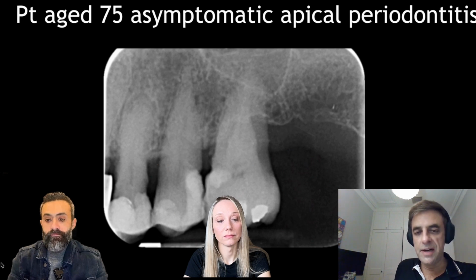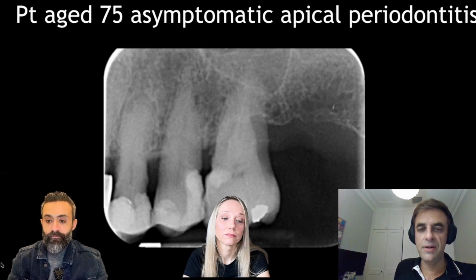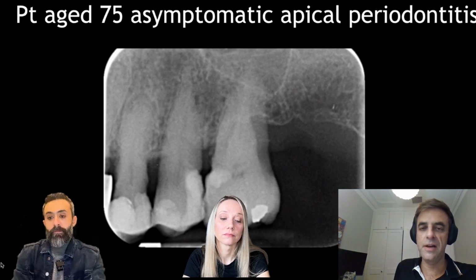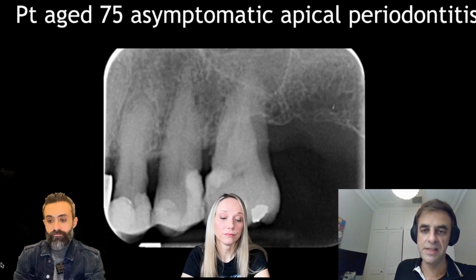Obviously, with the 2D radiograph, there are two reasons for taking a 2D radiograph in my clinic that I can think of that would be a good additional benefit to the CBCT. One is to look at the restorative margin, because a lot of the CBCTs show sections of the restoration, and there's a bit of scatter and things like that.